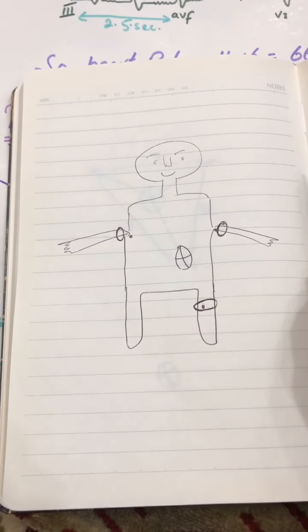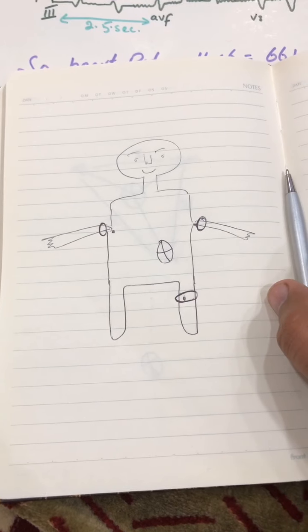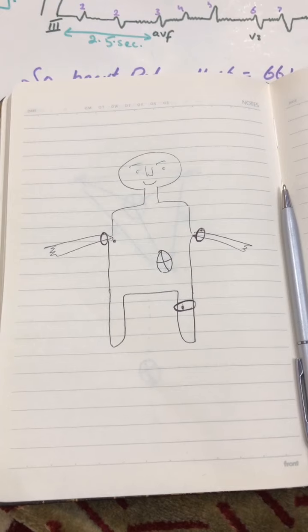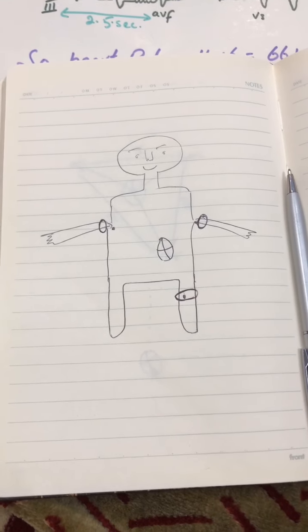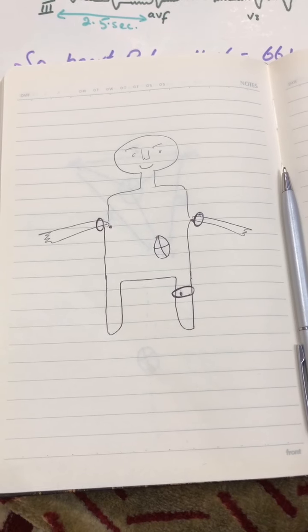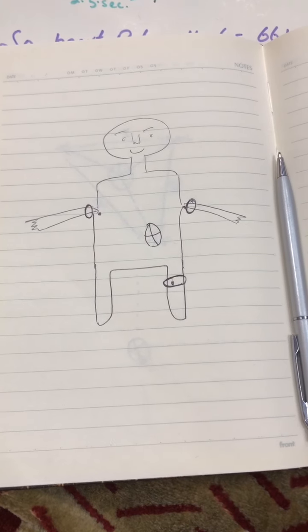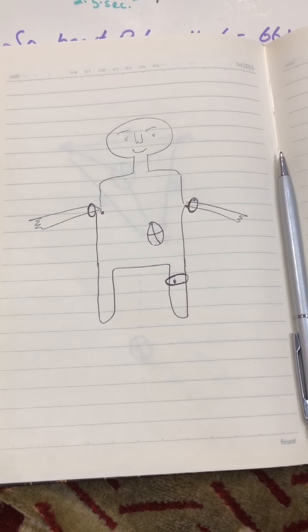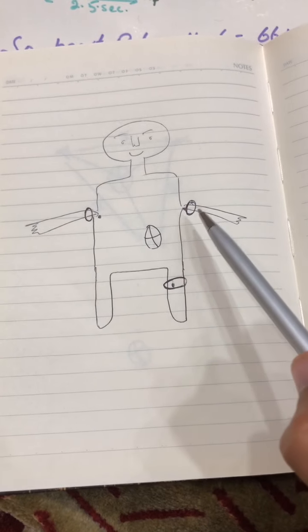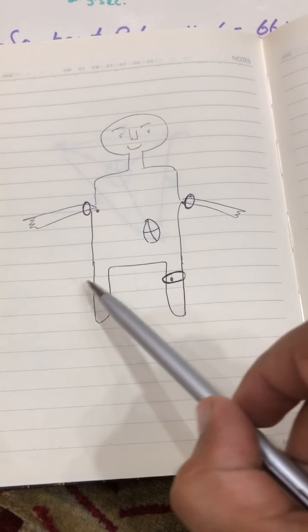See, we have 12 leads in this ECG that we are using in the normal daily routine in the hospitals. Okay, these 12 leads consist of 4 limb leads, in which 3 actually have voltage, but the fourth one does not. See, one we connect to the right hand, one to the left hand, one to the left foot, and one to the right foot.